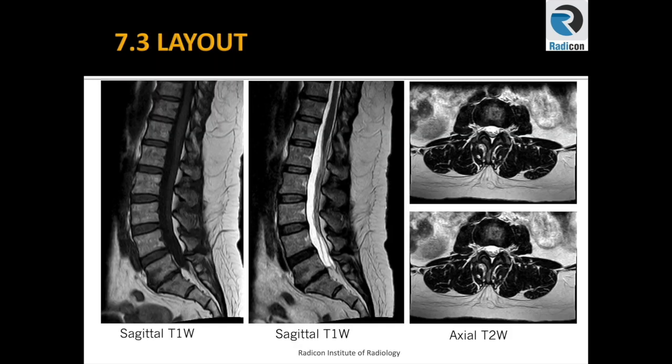If I have to give one tip to beginners for Lumbar Spine MRI, I would suggest spending time on the layout. Be very consistent in how you display your images — it gives great insight into sequences, their limitations, and awareness of subtle changes in appearance across different pathologies. I always place sagittal T1 and T2 sequences side by side on the left side of the screen, and axial images on the right, allowing an initial survey of the spine on sagittal images before disc analysis at each level.